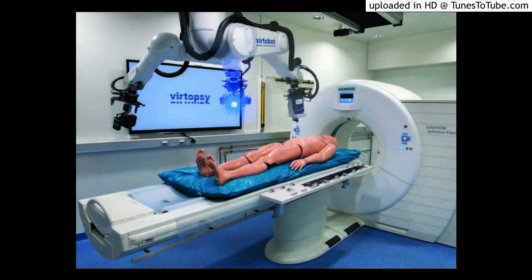History. Wallenweber et al., 1977-8, initially applied CT in forensics in order to identify radiographic patterns of gunshot injuries to the head. The foundation stone for use of digital autopsy was laid down after the generation of the virtual mummy at the British Museum in the year 2004.